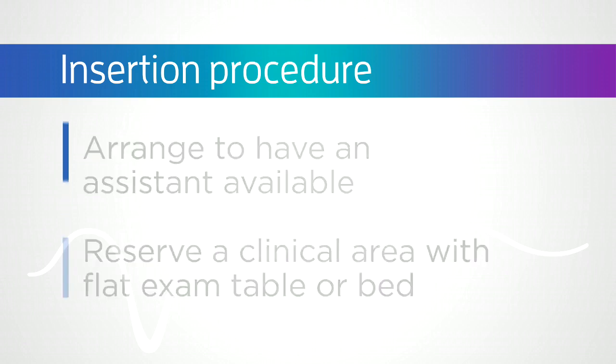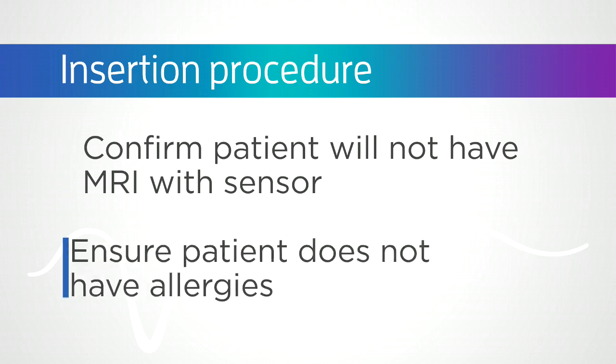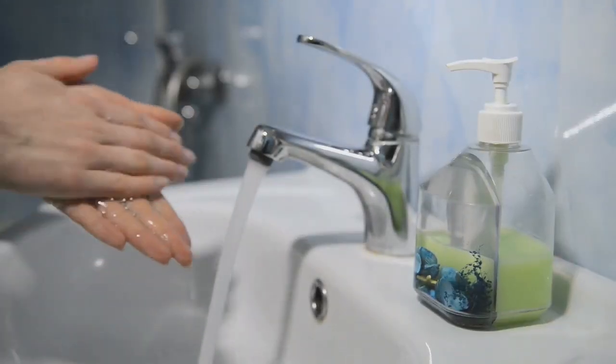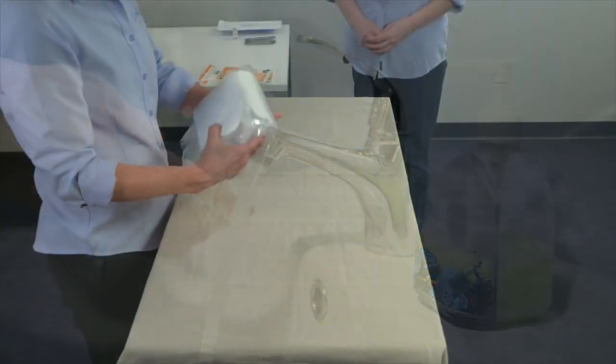bed. Confirm that your patient does not plan to have an MRI for the duration of the sensor wear, and ensure that your patient does not have allergies to the approved antiseptic or anesthetic that will be used during the procedures. If you have a cough or a cold, wear a mask. Once you have thoroughly washed and dried your hands, you are ready to begin.